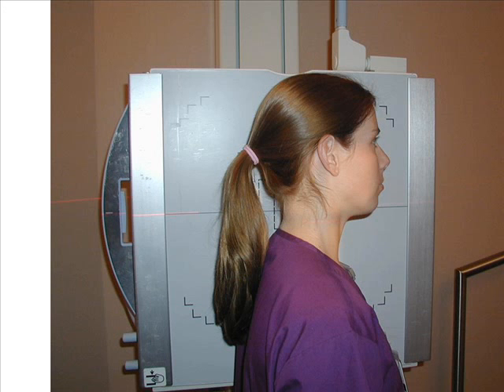Position the patient in the erect lateral position with the shoulder against the cassette and the chin elevated. Place a lead shield around the patient's abdomen for radiation protection.